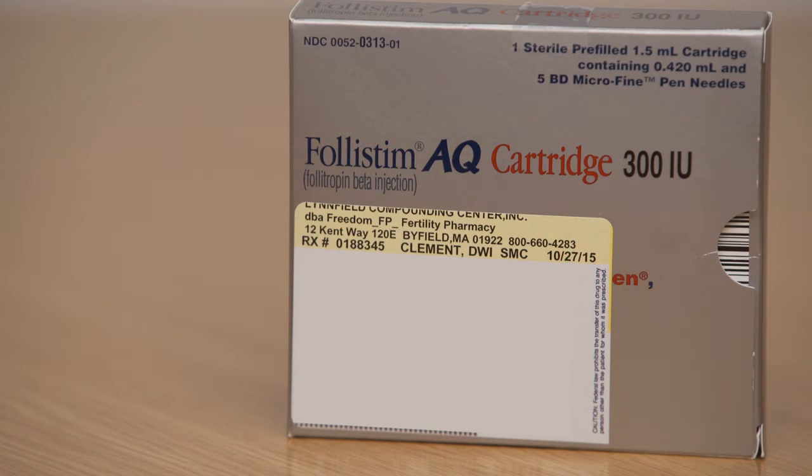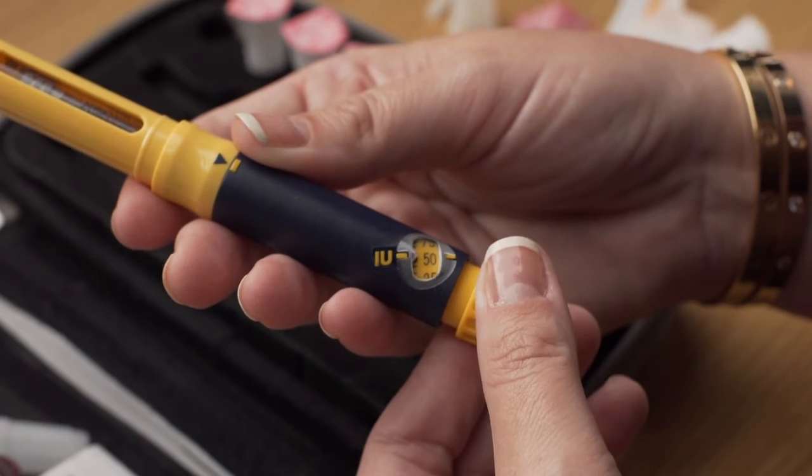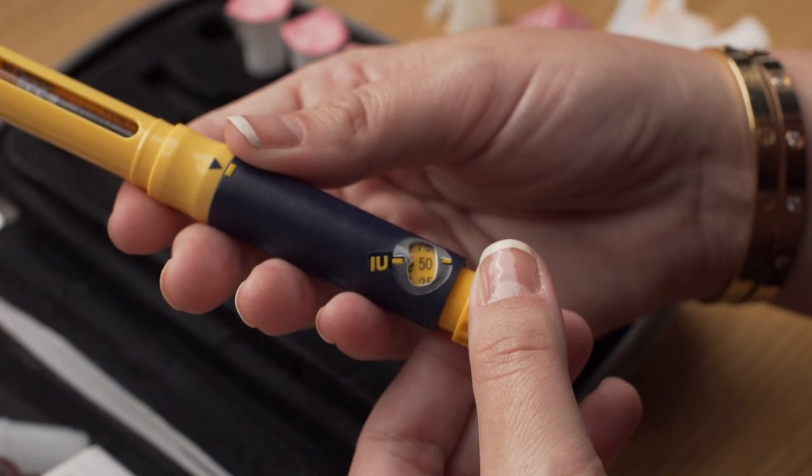Your Follistim AQ cartridge will contain either 300 IUs, 600 IUs, or 900 IUs. For doses of 50 IUs up to 450 IUs, turn the dosage knob to line up the dot beside the correct number on the dosage scale. If you dial past the correct number, you have to dial the knob all the way out before it will go back. Do not try to turn the dosage knob backward. Continue to turn the dosage knob in the same direction past the 450 IU mark as far as it will turn. At this point, the knob will start to move freely and you can push the injection button all the way to start again. Once you have set the Follistim pen to the correct dose, you are ready for your injection.